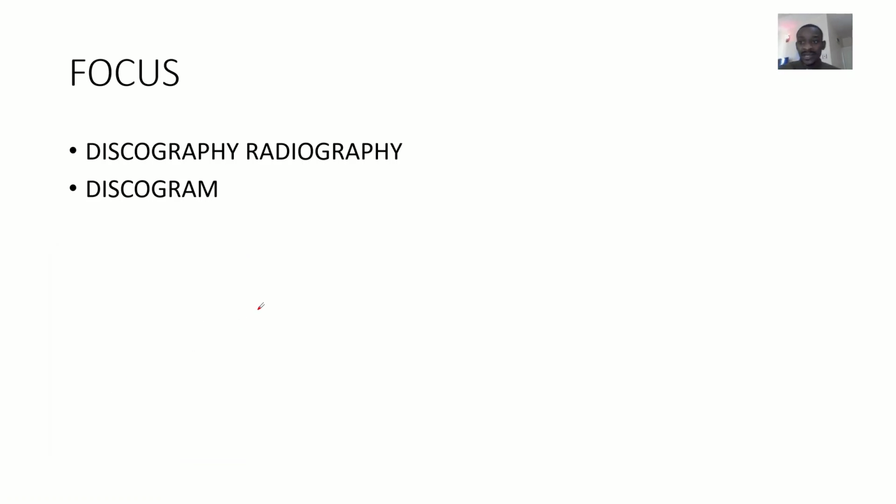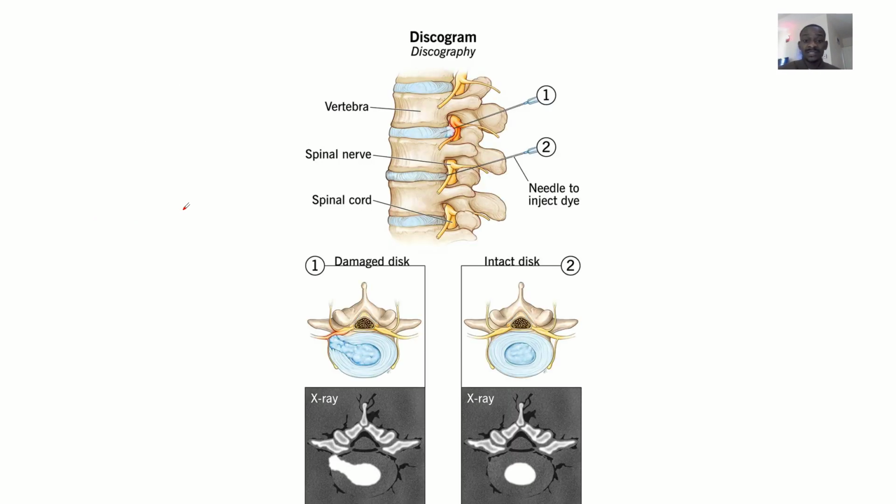Okay, guys, so we're here again talking about discography, radiography, or this discography, you can also call it a discogram. Okay, so it's another form of imaging, an imaging modality.